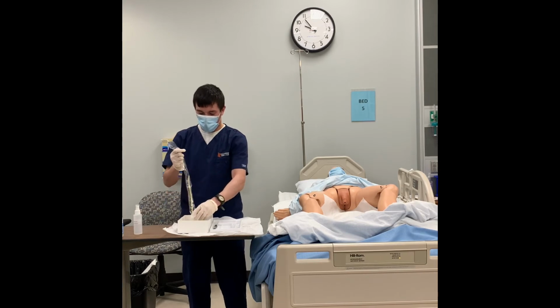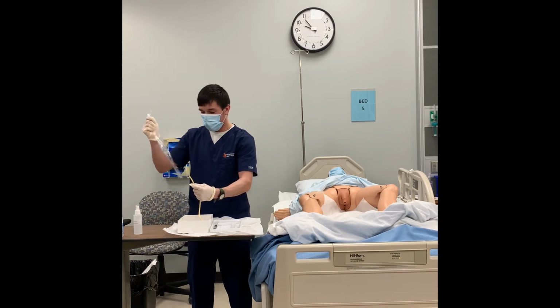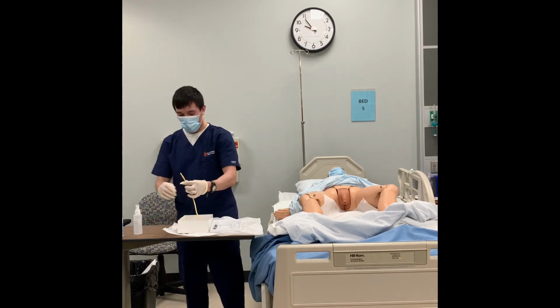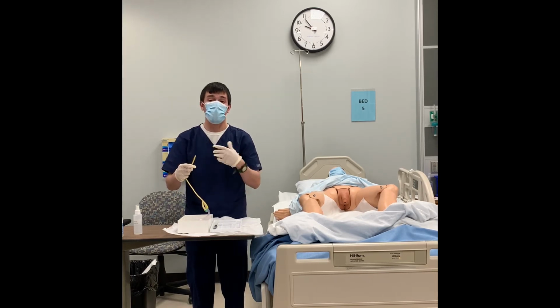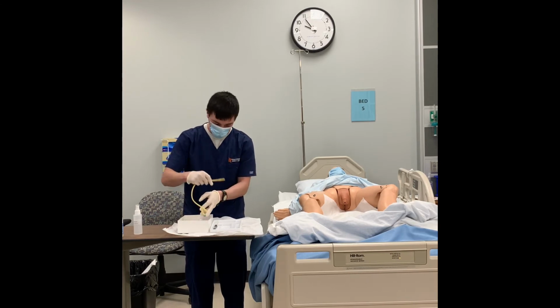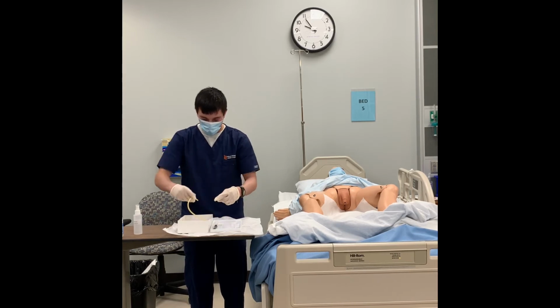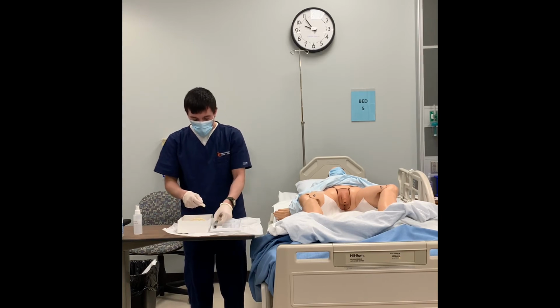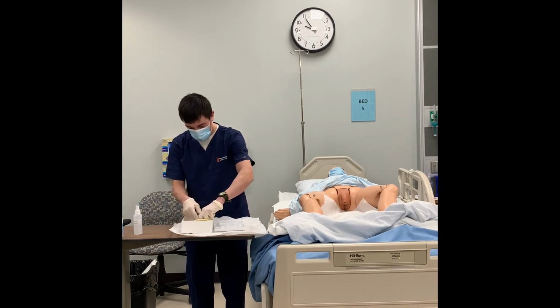Now I'll go ahead and remove this, making sure that as I do it, I try to coil this up or grab near the top, and then pitch that to the side, throw it away. That way, I coil it up so it doesn't fling around and it doesn't touch the non-sterile field. So now I'm going to go ahead and lubricate. There we go. All right, and now I'm going to go ahead and place it back inside of the box, and grab my syringe, and now I'm going to attach it to where it needs to be.